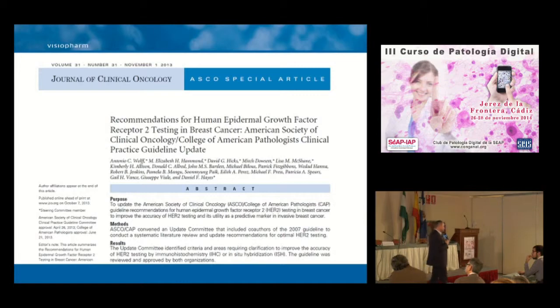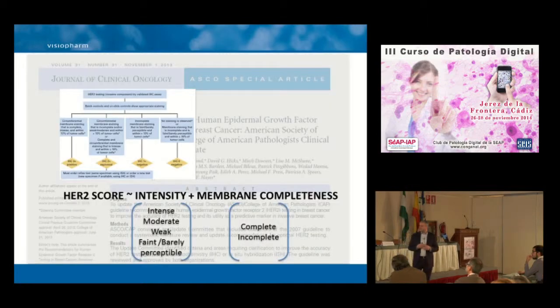So when we're trying to interpret HER2 protein expression, the ASCO-CAP guidelines that have been issued recently, a renewal from 2013, is telling us how we should read and interpret HER2 protein expression. And that's being incorporated in guidelines across most of the world, certainly not just in the United States, but even here in Europe. So what does it tell us?